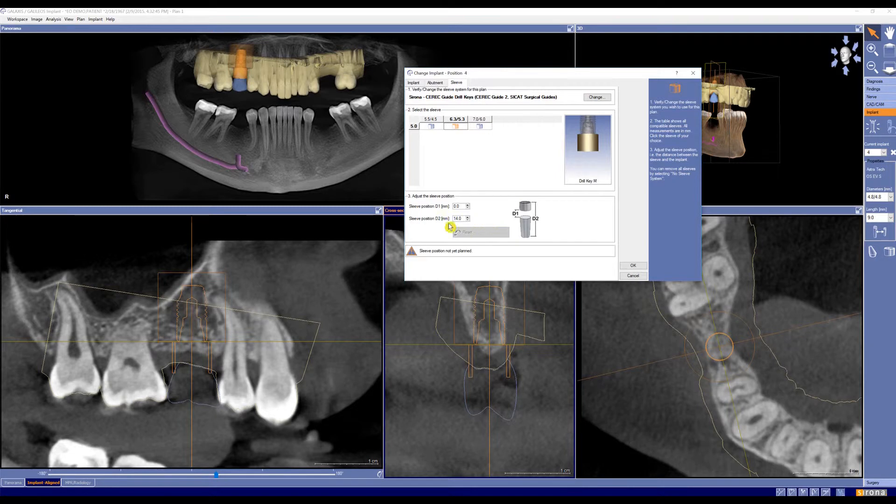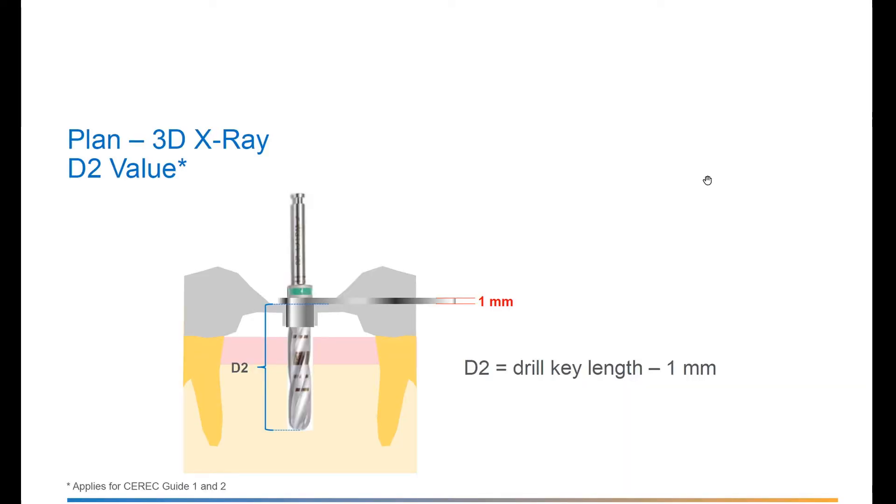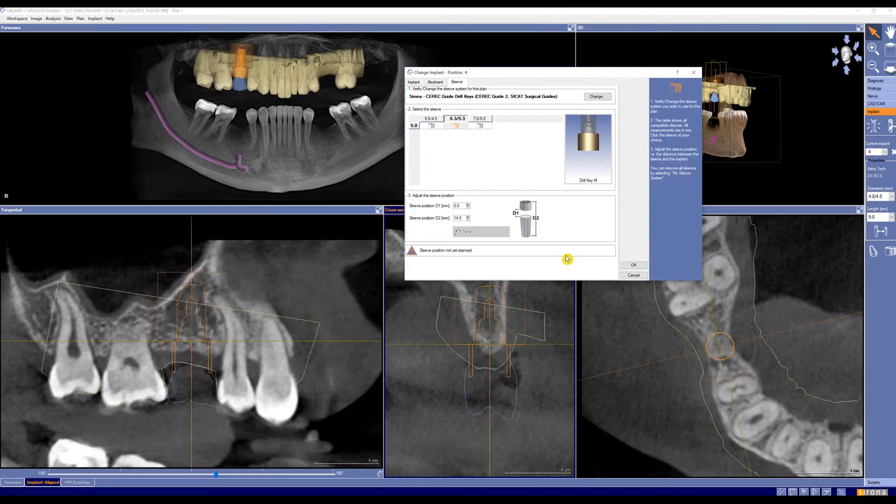Now for sleeve position, we need to set the D2 value. D2 equals your drill length minus one millimeter for the key. If you do not know your drill lengths, please contact your implant company and they will be able to help you with that. So let's say that our drill length is 22 millimeters. Because D2 is drill length minus one millimeter for your key, our D2 value is going to be 21. D2 equals drill length minus one millimeter.